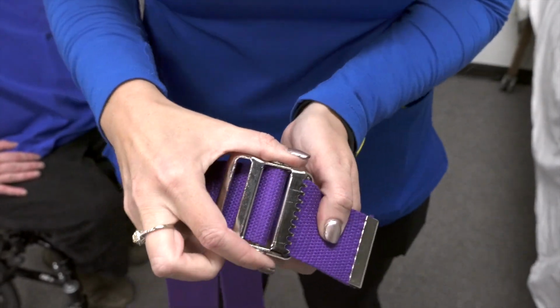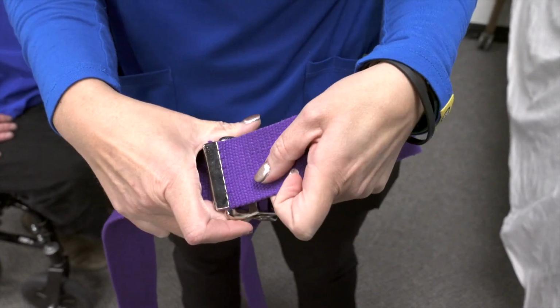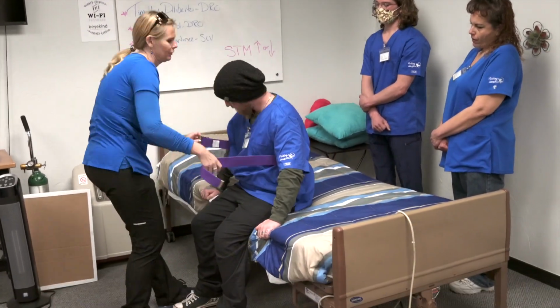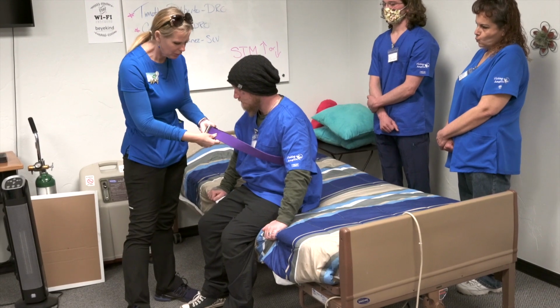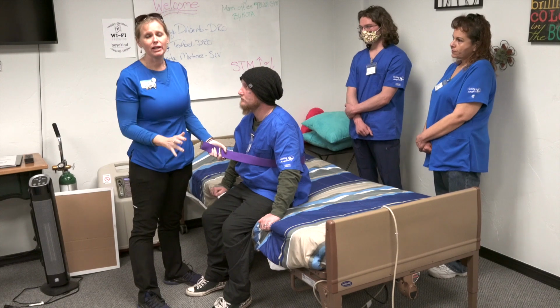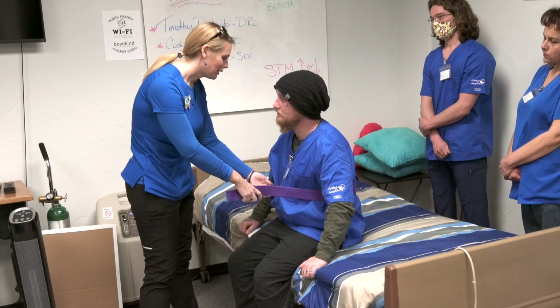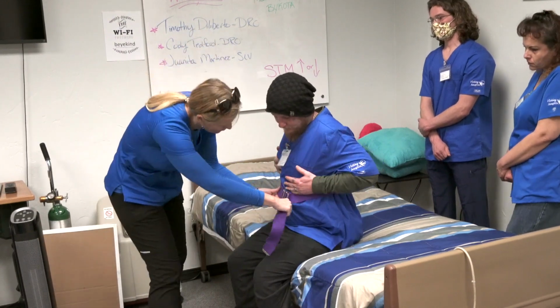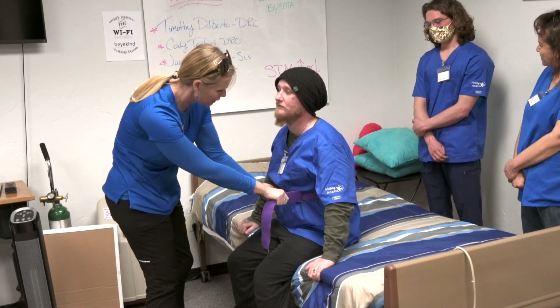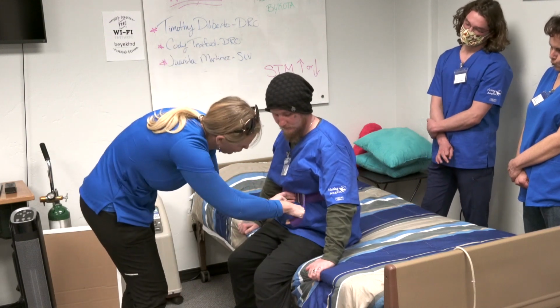We're going to start by getting it locked into these teeth. It'll come in through the teeth first, and then to lock it into place, we're going to go through this little opening here. All right? So Mr. Cody, I'm going to put this on. Excuse my reach. Now, important note for our 70-year-old women, they might not be wearing a bra. So we want to make sure that everything is up and out of the way, and we might need their assistance. So Cody, would you please make sure the girls are out of the way? Thank you. Then we're going to get this as tight as we can, and we're just going to need 2 fingers, okay? So get it fairly tight around the waist. We're going to come back around.